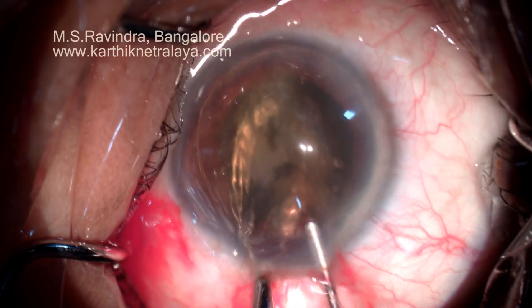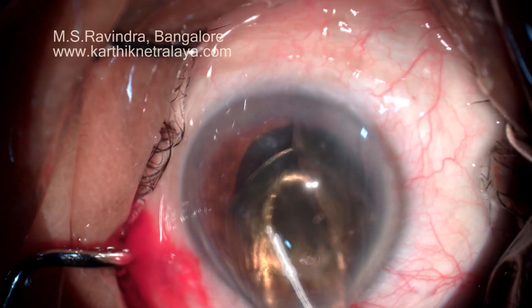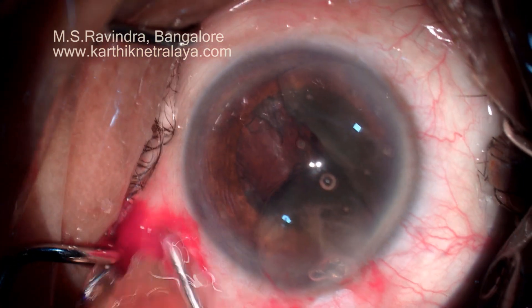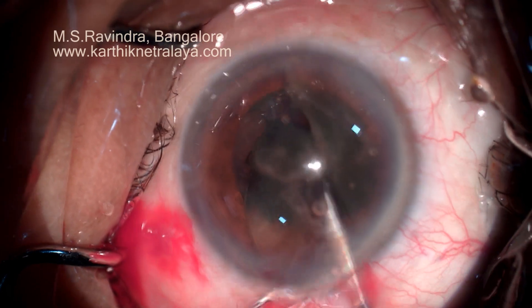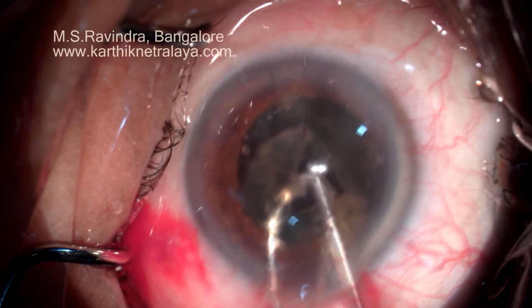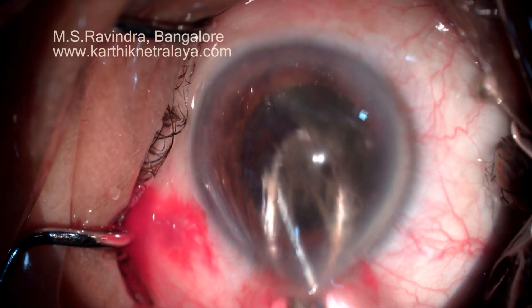A sustainer holds the nucleus and the cystotome bisects it. The nucleus is now prolapsed into the anterior chamber — it's already bisected. It is then extracted from the anterior chamber using continuous inflow of viscoelastic in front of the nucleus using a 25-gauge cannula.